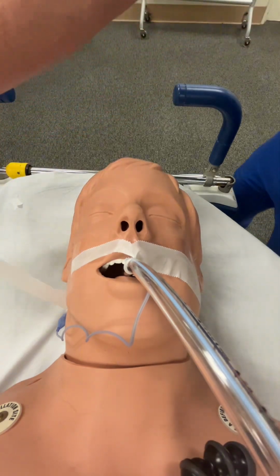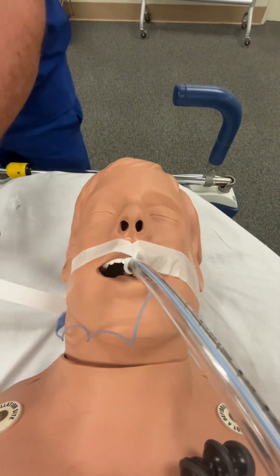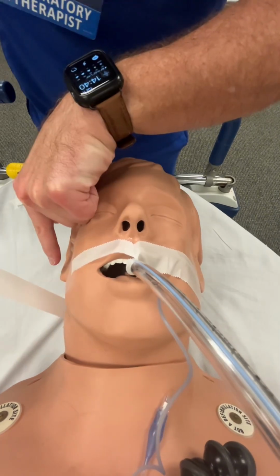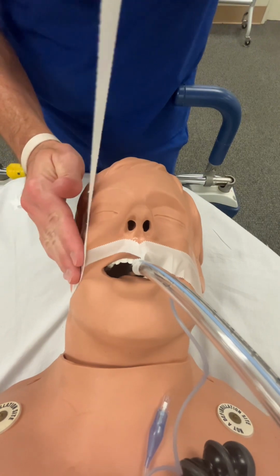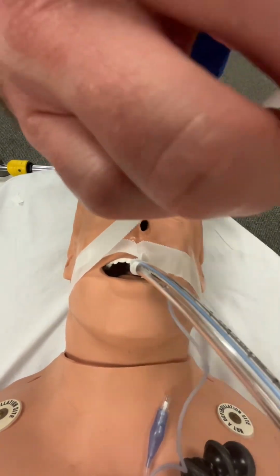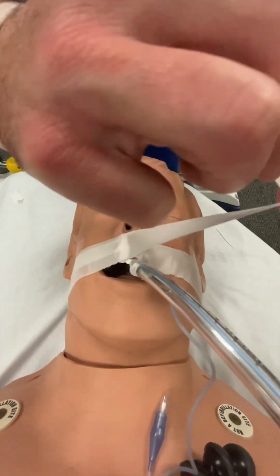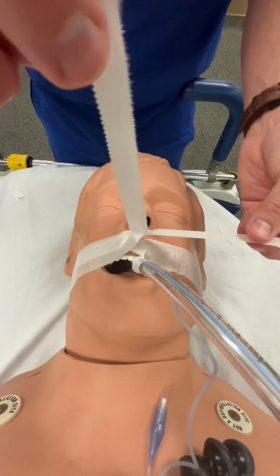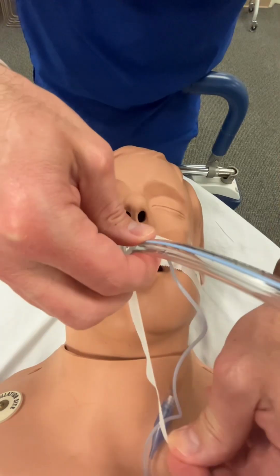Okay, I'm going to unroll my tape as much as I need for the other side. If you used a tongue depressor, then you'll just unfold it. As I wrap it towards the patient's tube, I'm going to make sure again that I'm staying underneath the patient's earlobe, and then I'm pressing down as I go. Tear off any excess that you don't need because it might be quite long. Now you're going to split the tape on this side. You're going to put the tube right where the tape is split, so that way it secures it real nicely. I'm going to wrap it down and around.